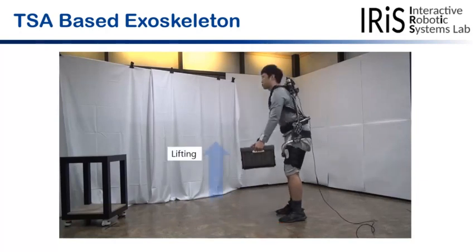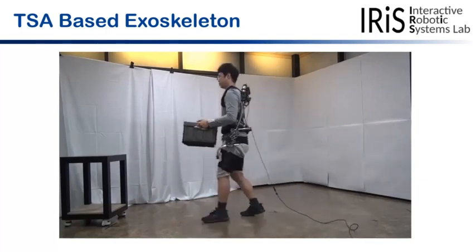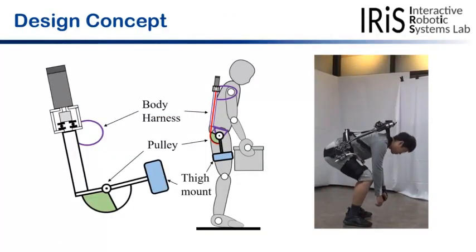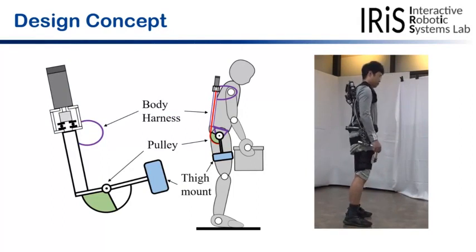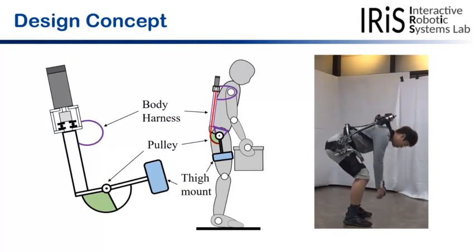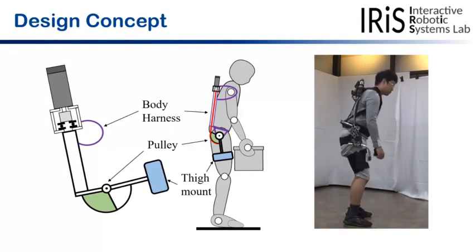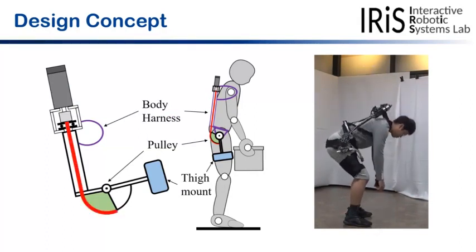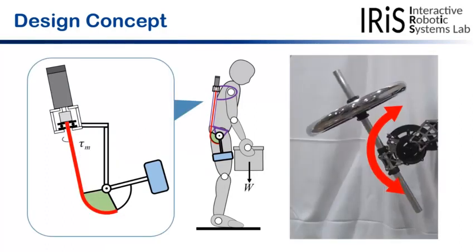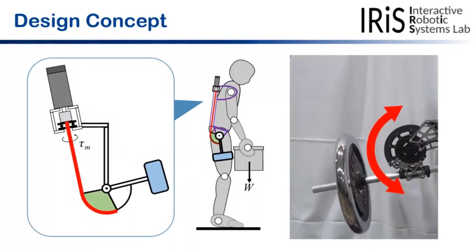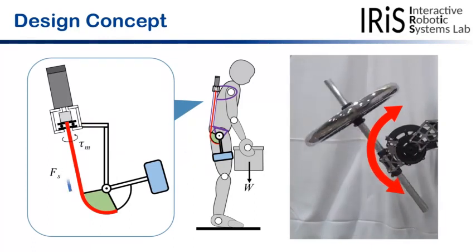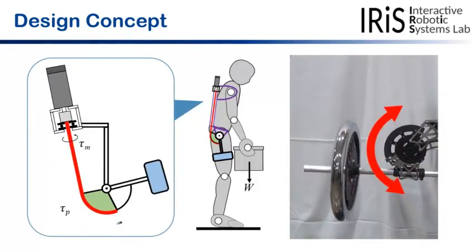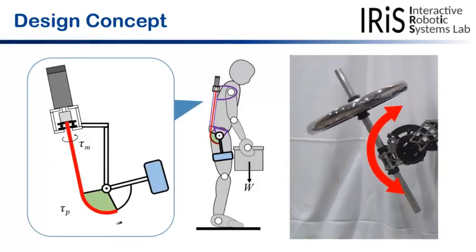This can compensate for the added hip joint torque due to the load on the hands. For designing our exoskeleton, we chose the most straightforward way to make the device compact and lightweight as possible. The string of TSA is routed along the wearer's back to the hip joint. The motor torque is converted into a large linear force through a twisted string.